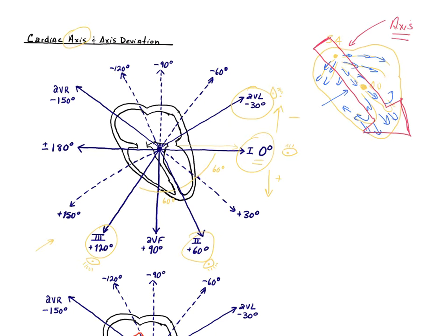Now, could I have just made this a complete circle from 0 to 360 degrees? We could have. Again, this is just how it all turned out. So this is a convention that we go with. The top part here goes from 0 all the way through the negatives to 180 degrees.